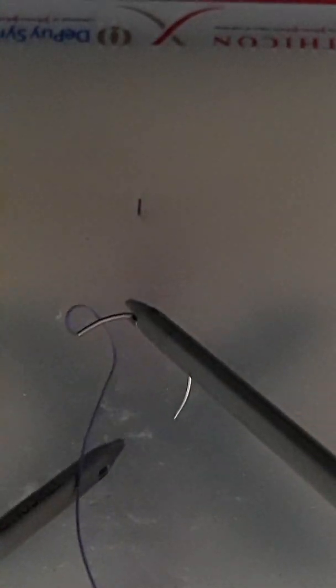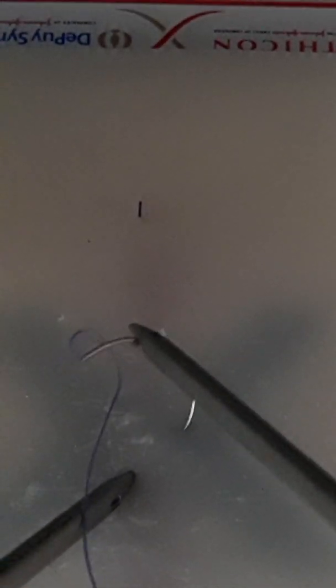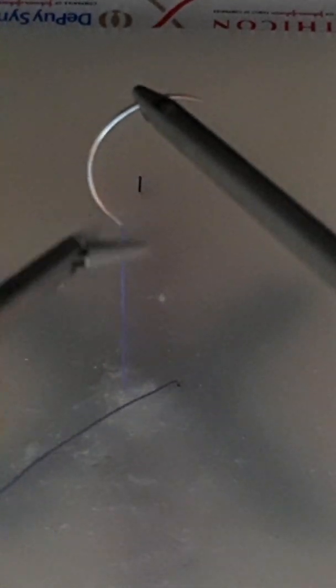Now to do this suture, we're going to take a bite. I'm going to retrieve with my right hand, with the molars as much as possible so you can be as effective as possible. I'm going to grab it about one centimeter—don't do it closer because you will bury the needle and it's going to be very difficult to find. Now I'm going to basically even out the length of the side that has the needle and the side that doesn't.